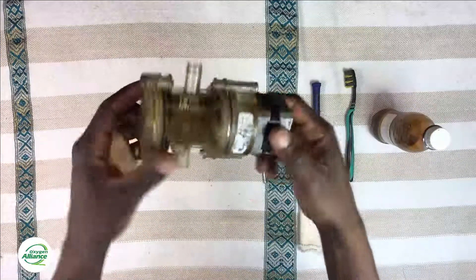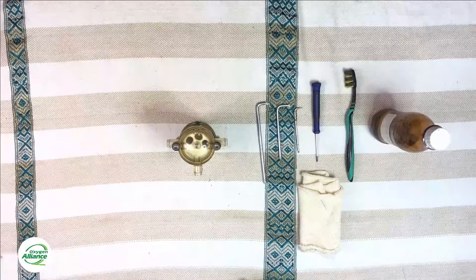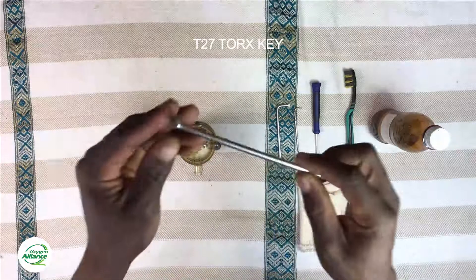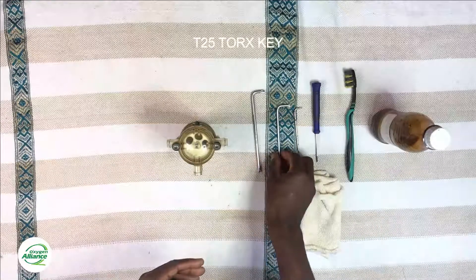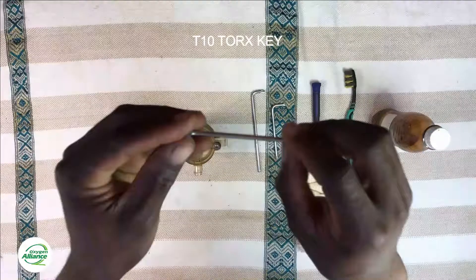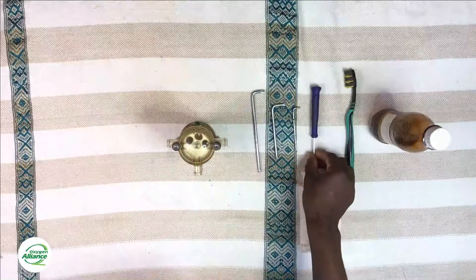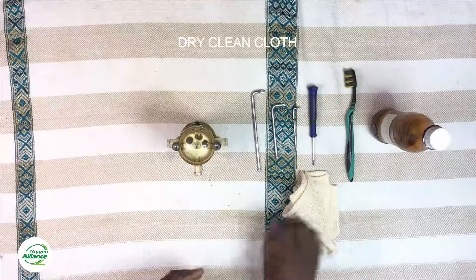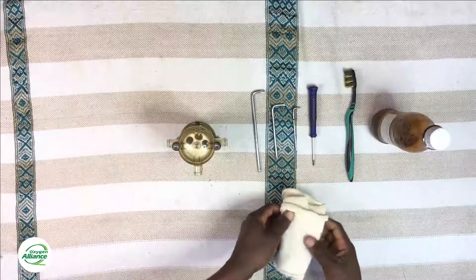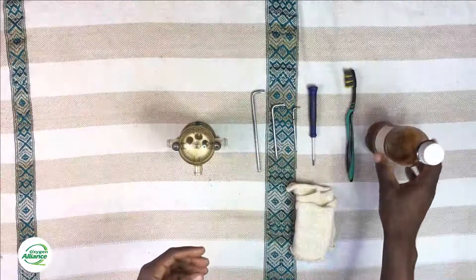In order to successfully disassemble, clean, and reassemble the rotary valve, you need to have the right tools. These include the T27 Torx key, the T25 Torx key, the T10 Torx key, and a flat screwdriver that you use to poke out some of the smaller components. You also need a clean cloth to clean the internal components, and benzene and a toothbrush to clean the Hall effect sensor in case it has some dirt on it.